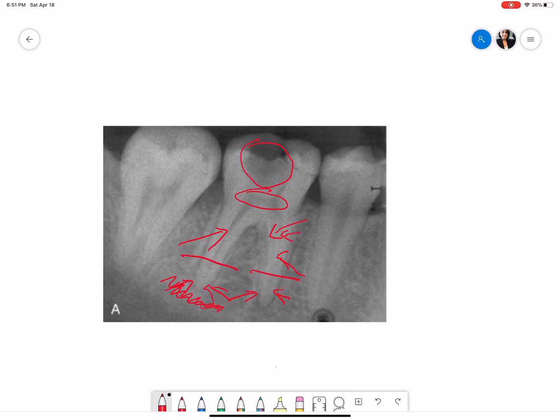So these features of widened periodontal ligament space, intact lamina dura, and sclerotic bone formation are suggestive of chronic apical periodontitis.